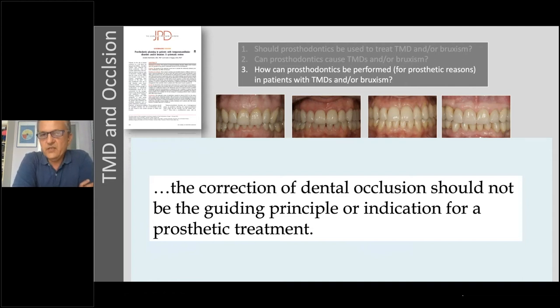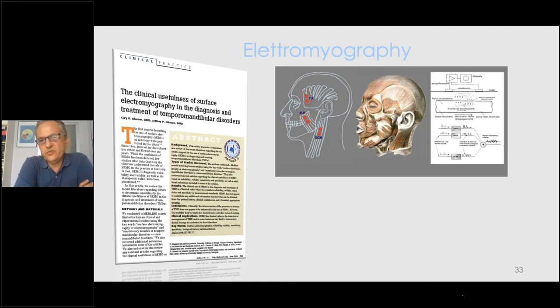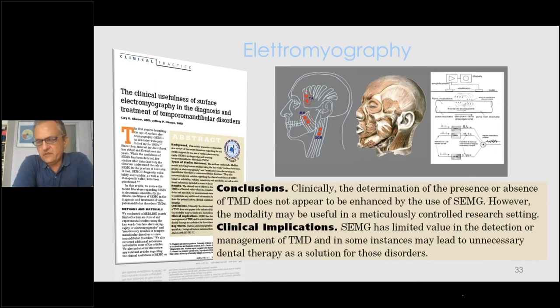in the occlusion. So what about electromyography then? Well, electromyography has a limited use within the realm of TMDs. And this is especially true for the type of electromyography that's based on the resting values. Meaning that the muscles can be evaluated during function or at rest. And of course, if we're using the rest values, then this is the more true. However, surface electromyography has a limited use.